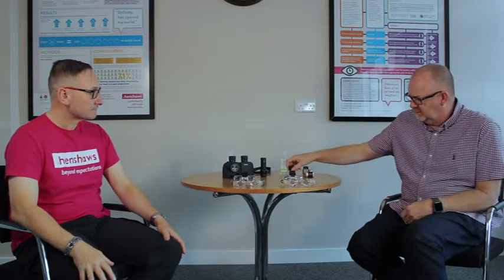And it's a kind of one-handed focus as well. Yeah, we'll get to the one-handed thing in a minute, but what people learn to do is twist and focus and get it set up in their pocket.